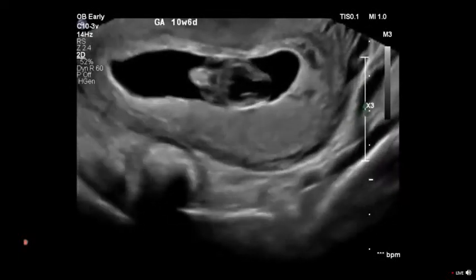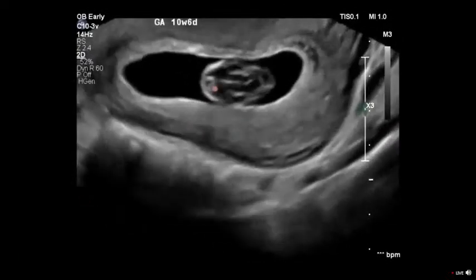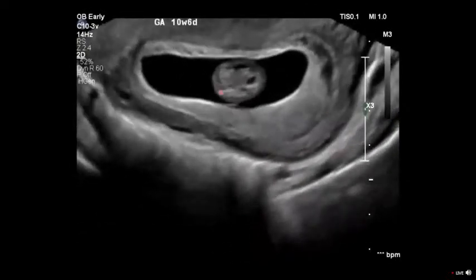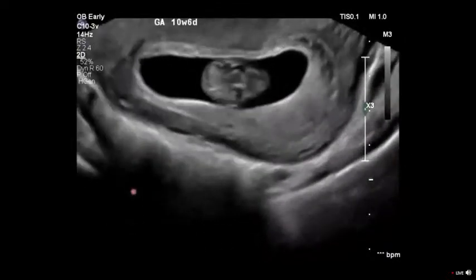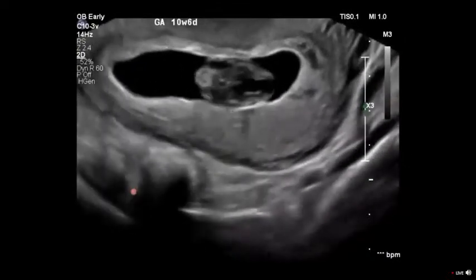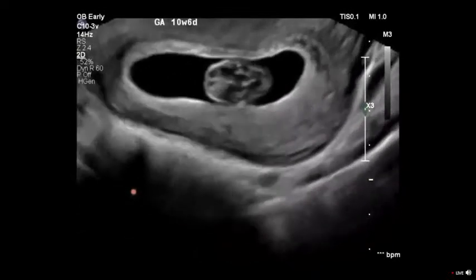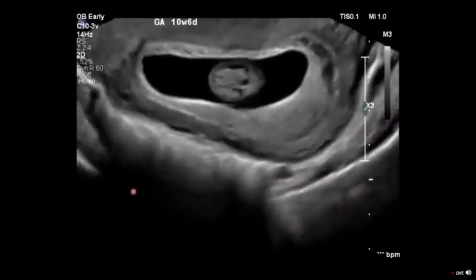So now maybe if up high, actually now I think I can see the cerebral hemispheres and the falx. So there's the 2 hemispheres, but it's a little bit lower, kind of in the back. What do you guys think about that? Any diagnoses coming to mind?